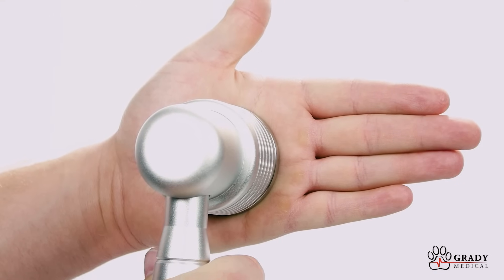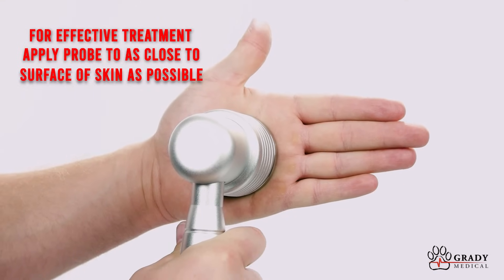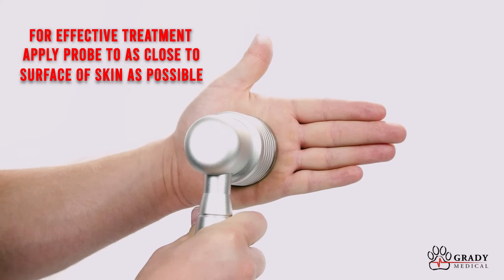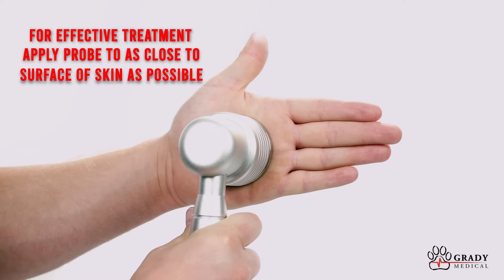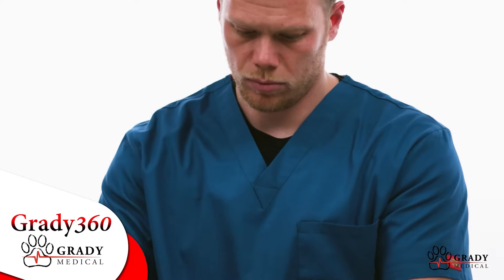Once we have our dosage set, apply the probe directly to the tissue that's being treated, and deliver the entire target dose to that area. Allow it to time down completely before moving to the next area to treat.